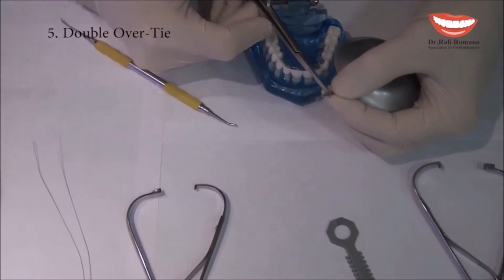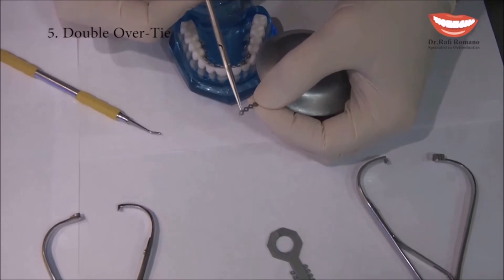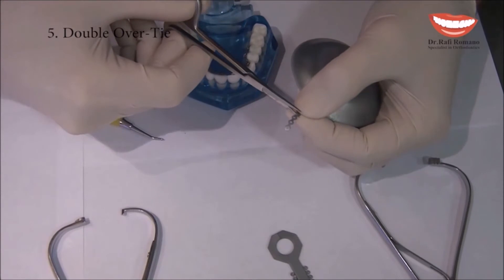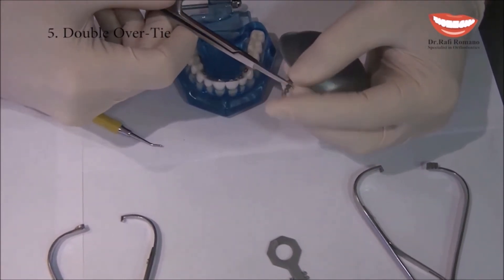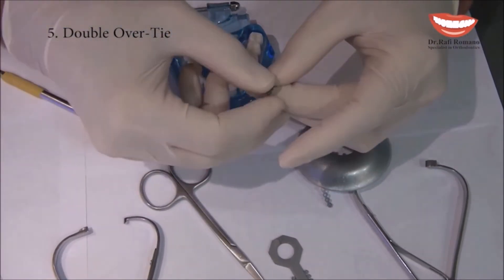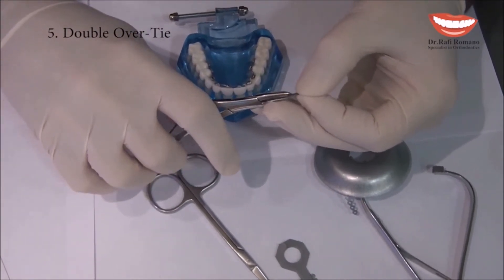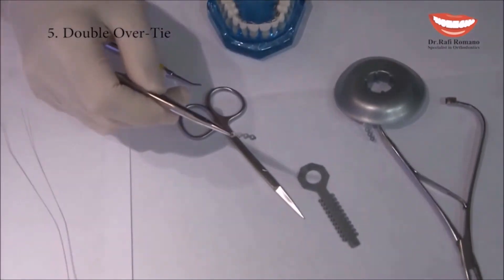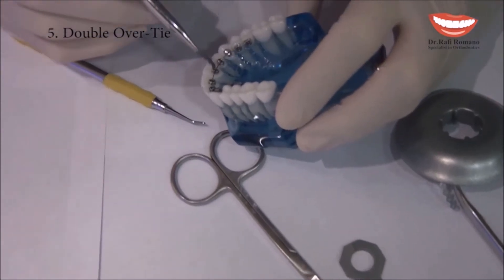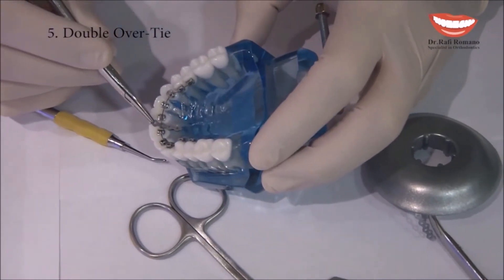Double Overtie, although we use a power chain, actually uses one elastic module under the wire and one above the wire. First, I cut a small piece of power chain with three to four links. Then I catch the power chain with the mosquito like this. Then I take off one of the elastic modules and put the power chain under the wire.